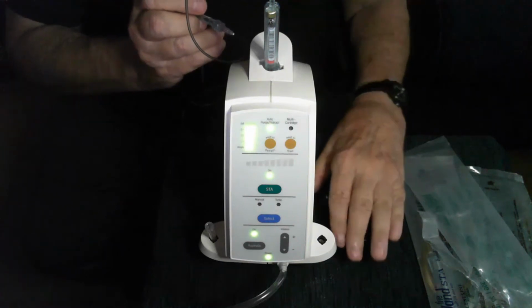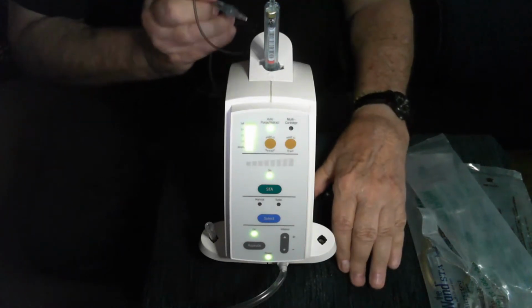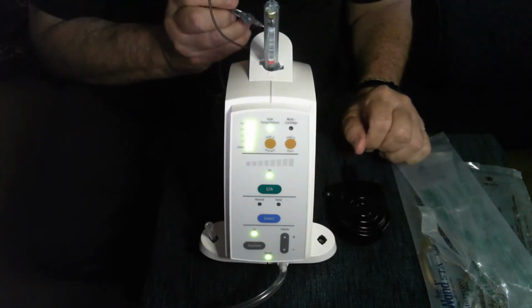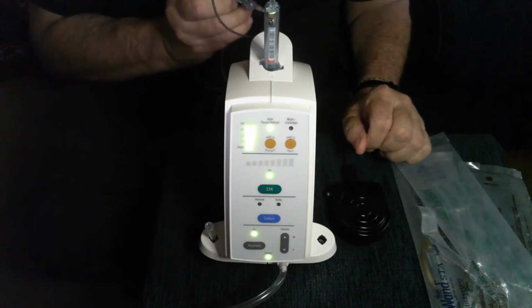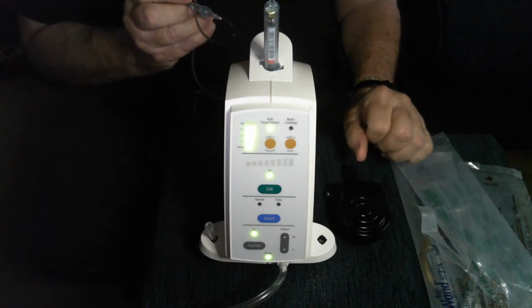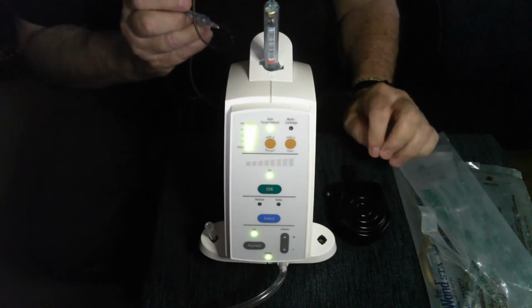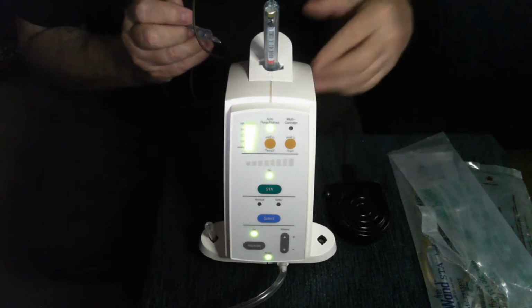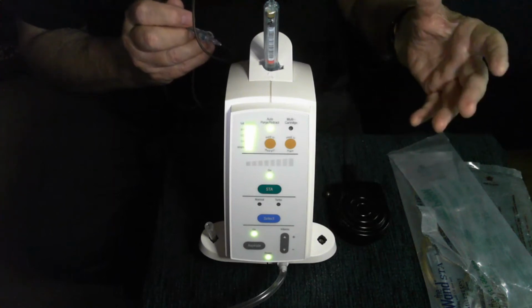When we want it to stop, we go into aspiration by hitting the foot pedal all the way down and releasing, and it now is in aspiration. It's about 6 beeps. So like I said, in the middle of aspiration, we take the needle out of the tissue without getting anything in the patient's mouth.